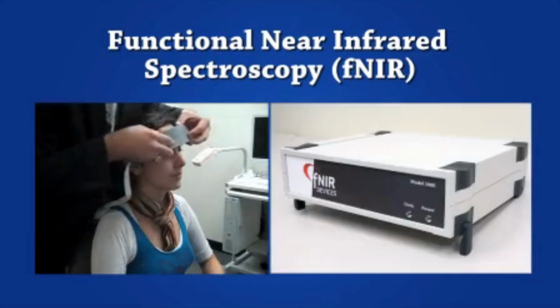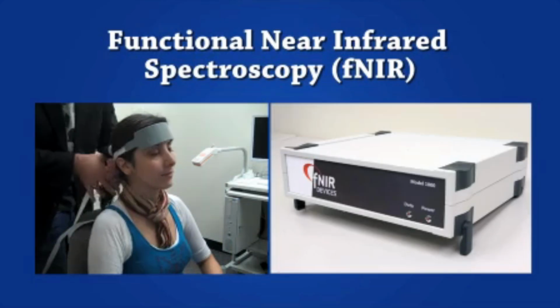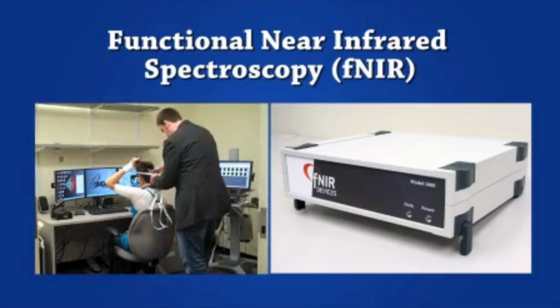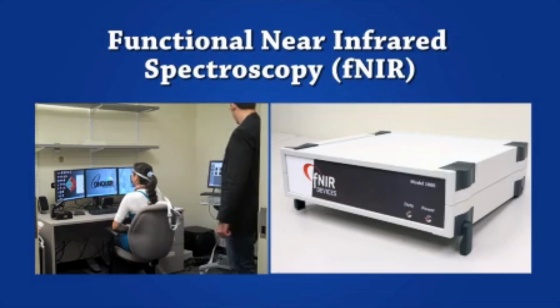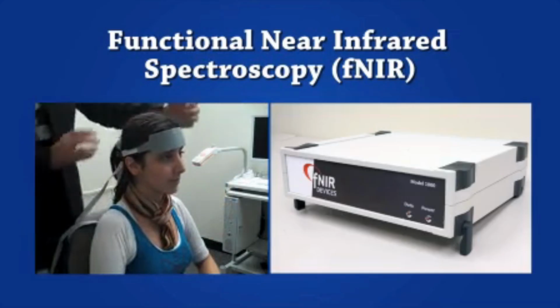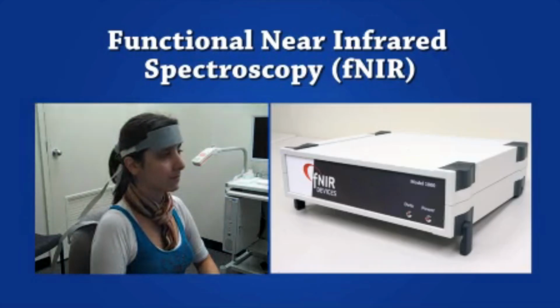In this study, we have used fNIR Devices Model 1000 that is based on the designs of Chance and colleagues in the 1990s and further developed at the Optical Brain Imaging Lab of Drexel University. This instrument does not rely on fibers or light guides to interface optodes with the skin. Hence, it is easier to set up, more comfortable for long sessions, and less prone to movement artifacts. However, this sensor is designed specifically for detection of cortical activation of the dorsolateral prefrontal cortex that is under the forehead and cannot be used in other head regions because of interference from hair.